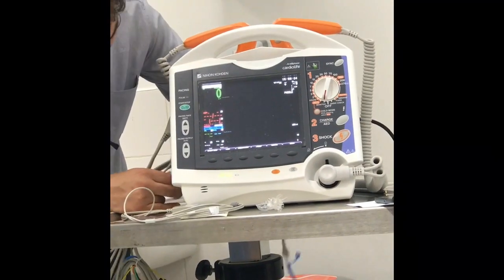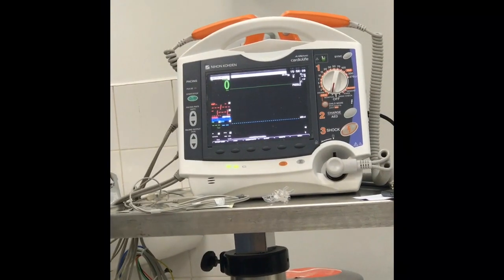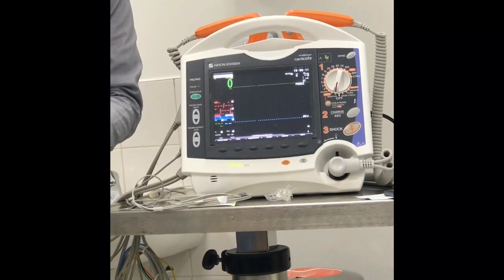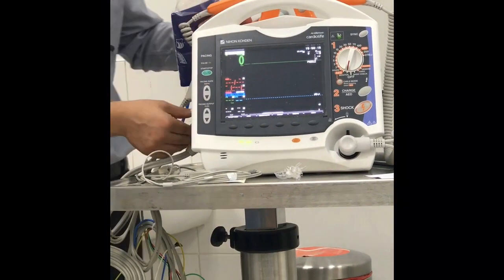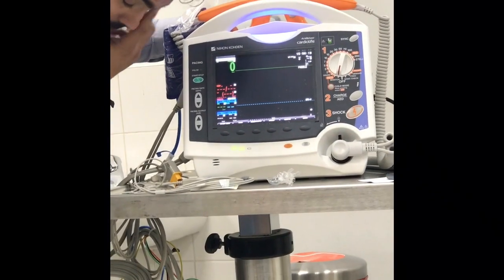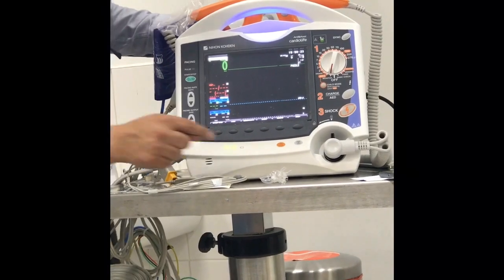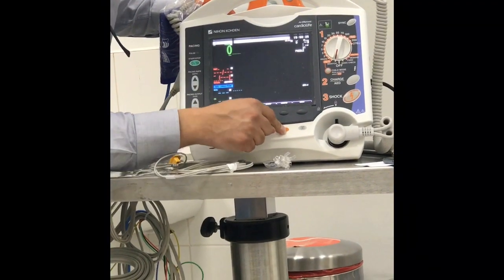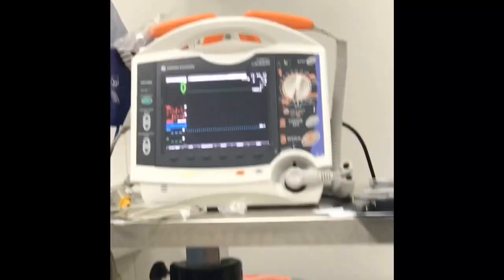Now, ETCO2 is there. If I don't need it, take it out. If the parameter is still shown, I can press the alarm silence. This is the refresh for the display. If I connect a parameter and the machine recognizes it, and then I don't need it, I take it out and press refresh. It will be refreshed. Okay. Then NIBP.